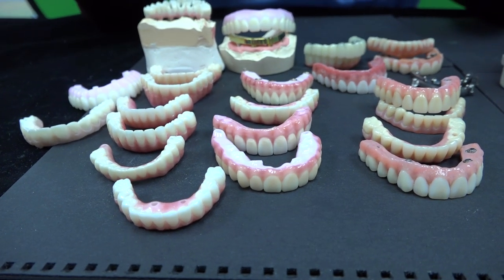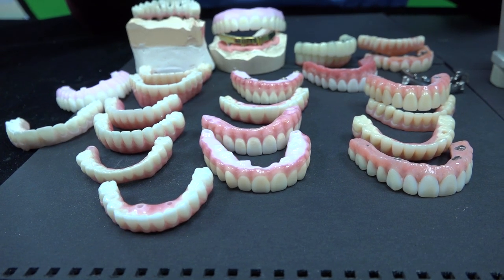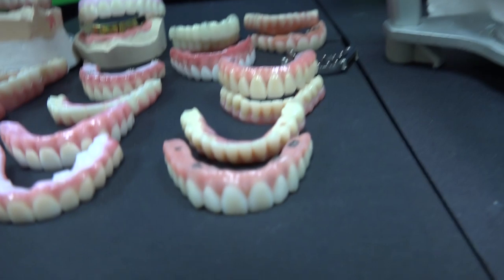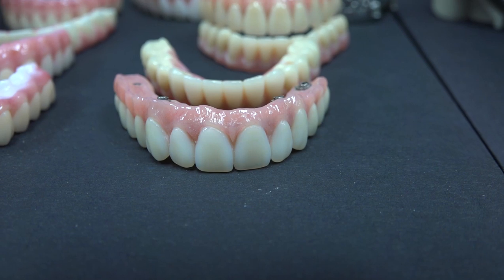The Dental Implant. Finally, we would like to talk about the dental implant, which is a full mouth cases. Number one, the acrylic options and zirconia options, and we have our hybrid options.